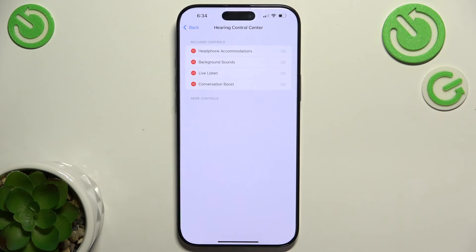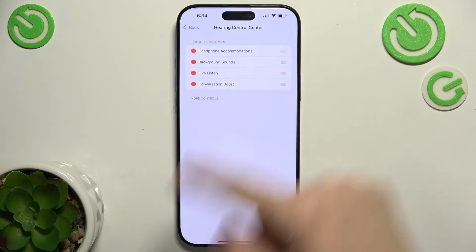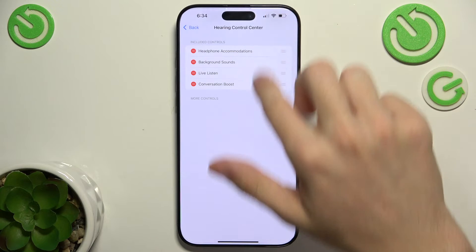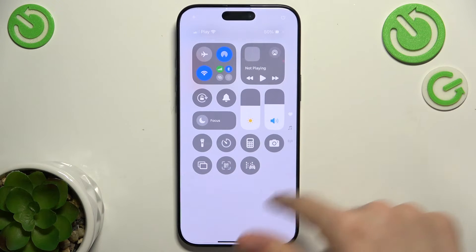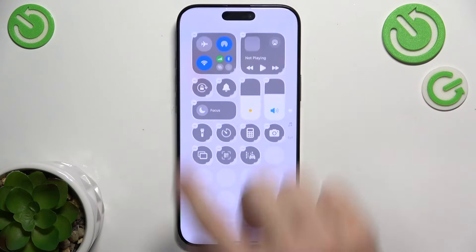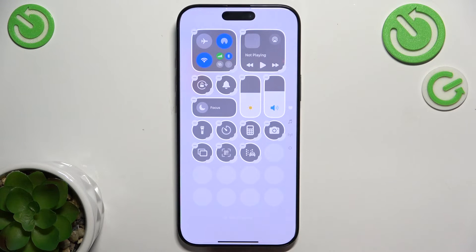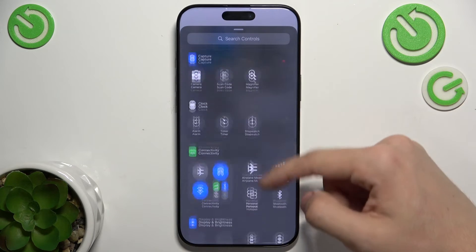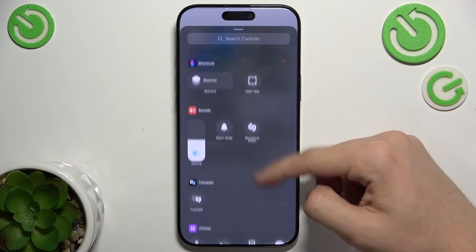Then Hearing Control Center — here you can choose what will be shown in the hearing control center. When you swipe from the right top part of your screen, this is the Control Center. You can add a hearing control by clicking on the plus in the top left corner, then Add a Control, then select Hearing Control.